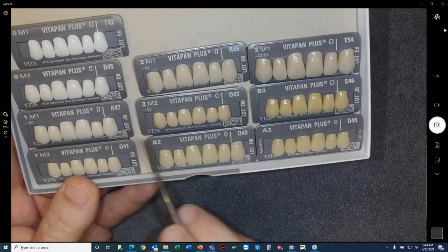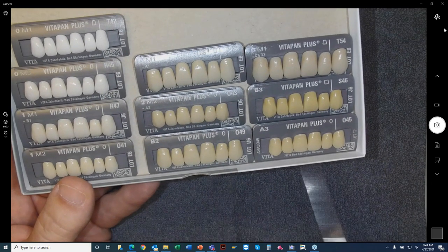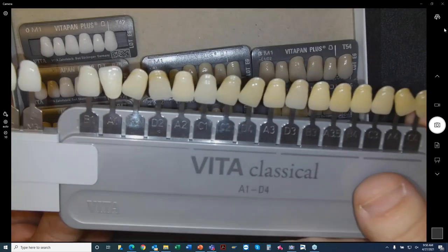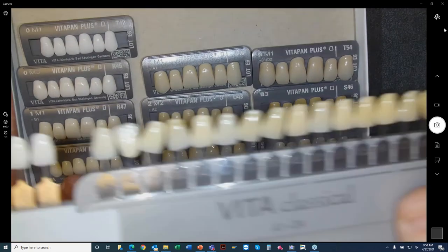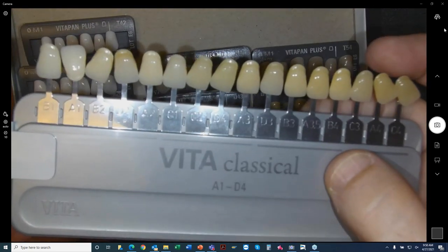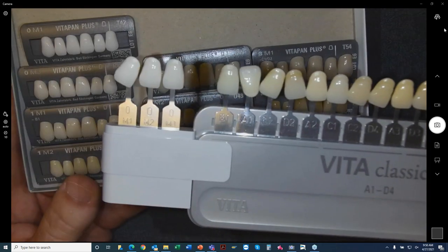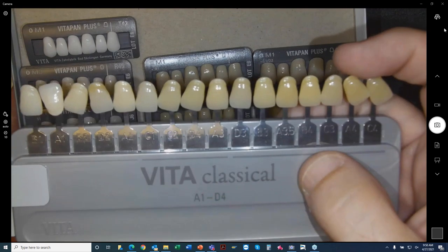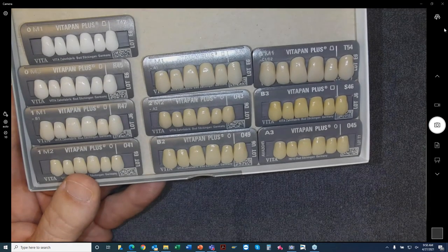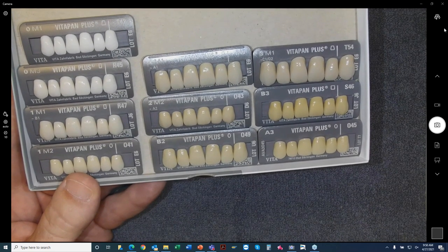So work with your dentist, work with your patients, and stop using a crown and bridge shade guide necessarily. Or if you do, you should have them limit the types of shades they are using. Again, there's 16 choices plus bleach, but most dentists only use 3 or 5 shades at all. So just pull out everything but those shades that they normally would use for the denture.